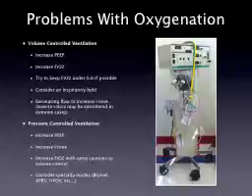Okay, now if volume control ventilation fails to work and my pressures are high, my lungs are non-compliant, I need to move on to pressure control ventilation. In pressure control ventilation, the way I improve oxygenation is by increasing the PEEP. I can also increase the I time. Again, this will decrease flow of gas and prolong the I time.